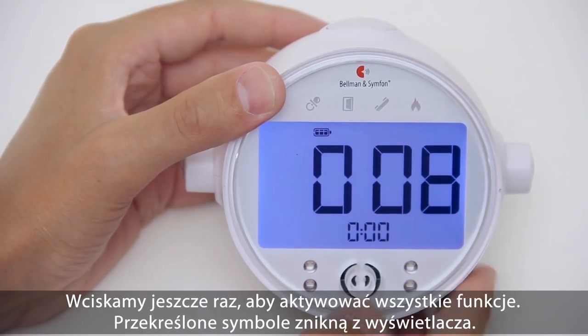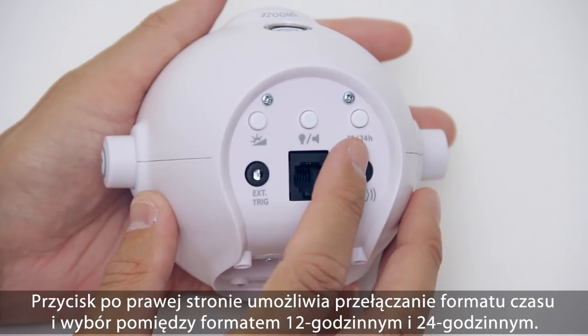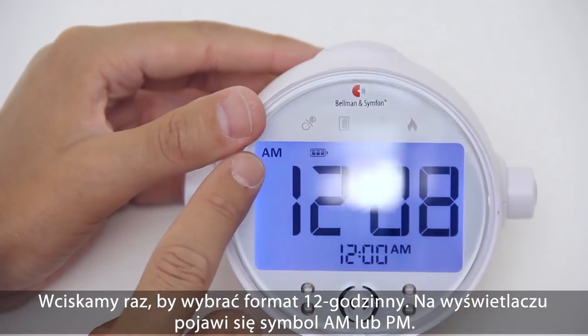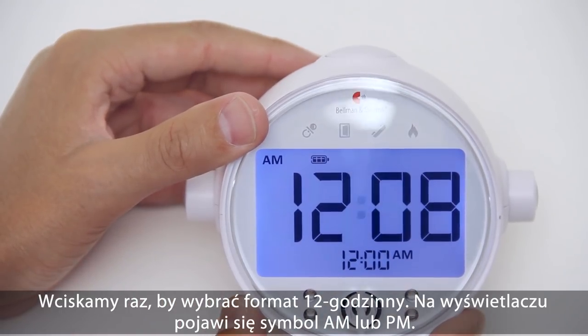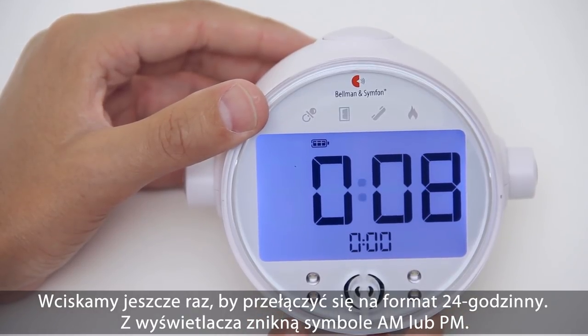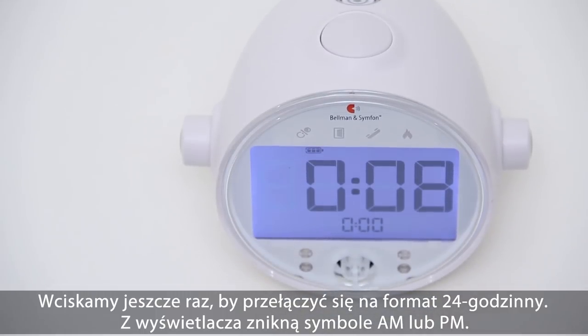The right button allows you to toggle between 12 and 24 hour time formats. Press it once to select 12 hour format — AM and PM will now appear on the clock face. Press it again to switch to 24 hour format, and the AM and PM symbols will disappear.